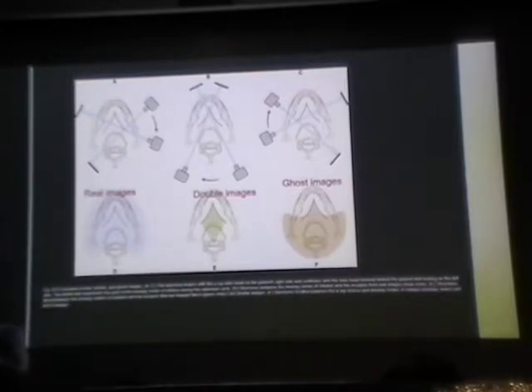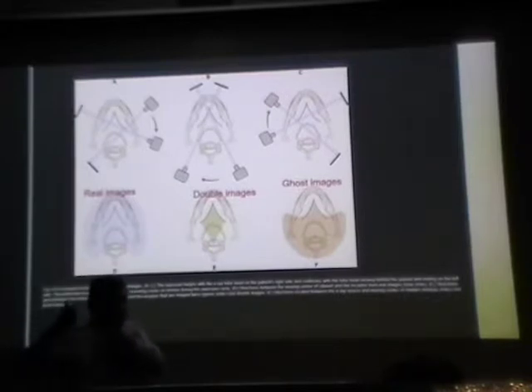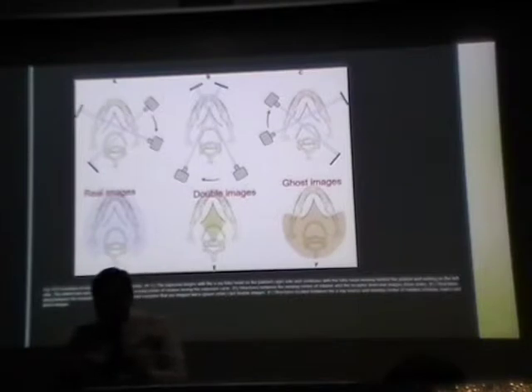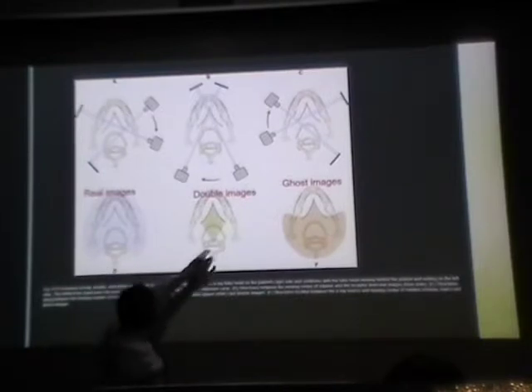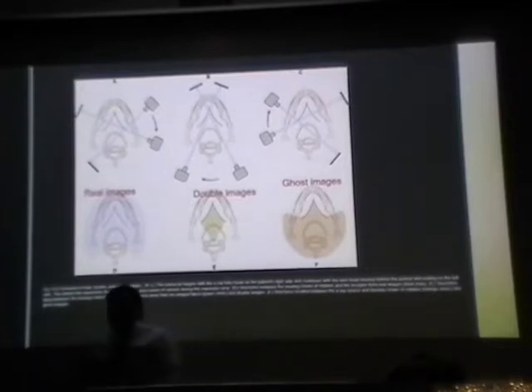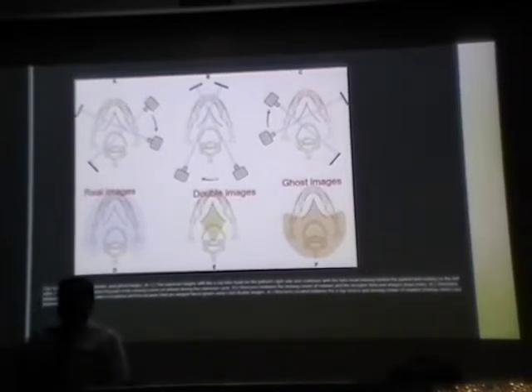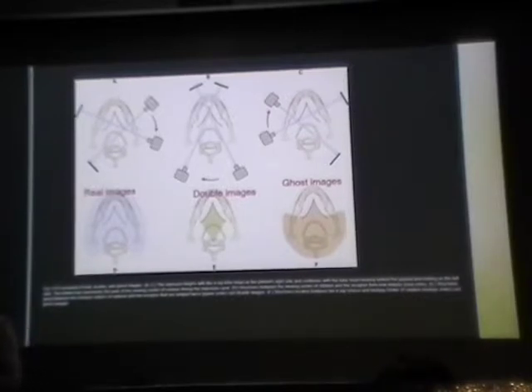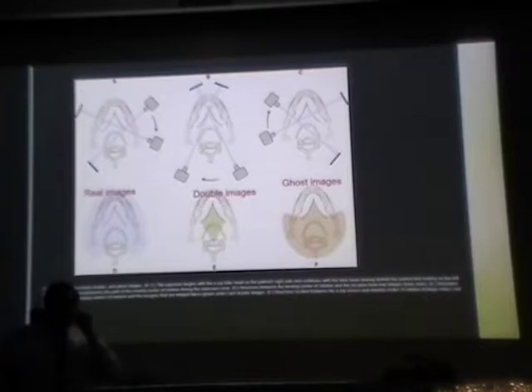So if you see something between the X-ray source and the center of rotation, those are the structures that you are going to see as ghost images. If it's in the midline, like in this region, you are going to see double images. For example, soft palate, hard palate, hyoid bone, epiglottis. These are all the structures you are going to see as double images. Okay. Ghost images, like for example, earring.